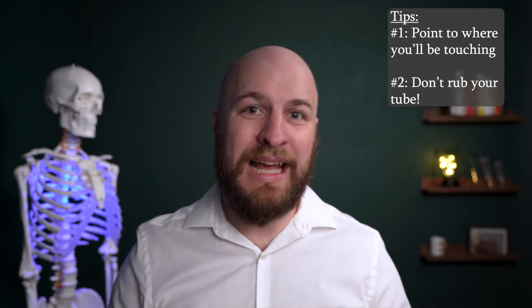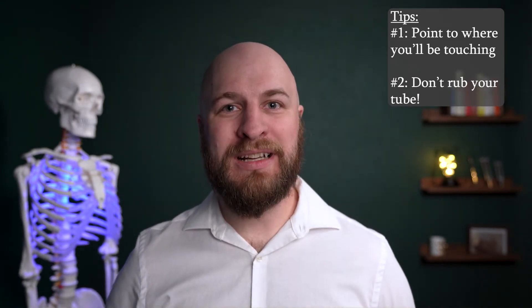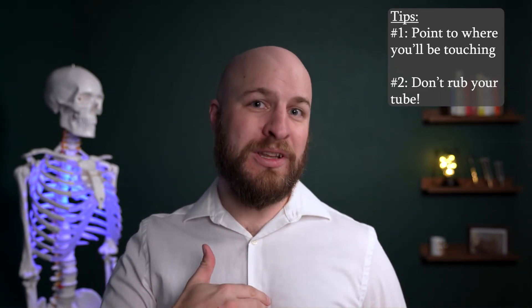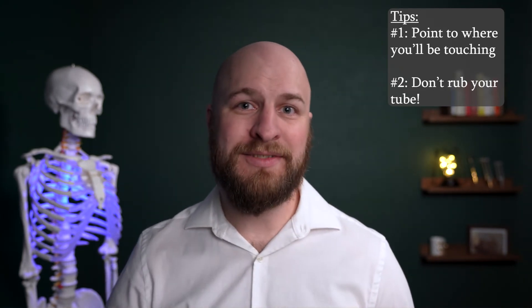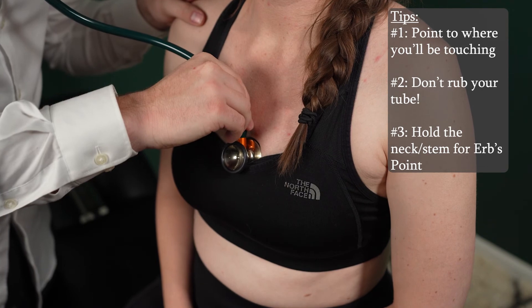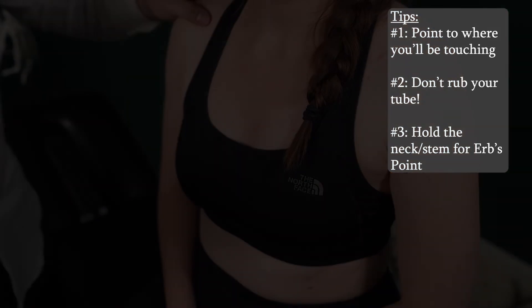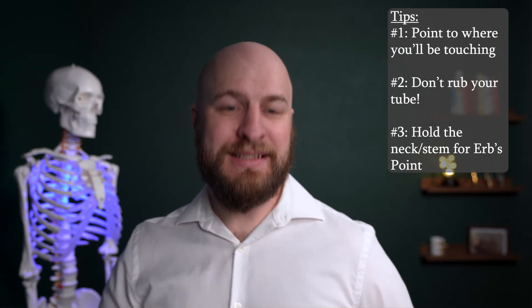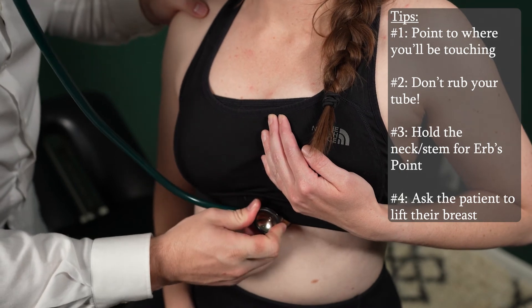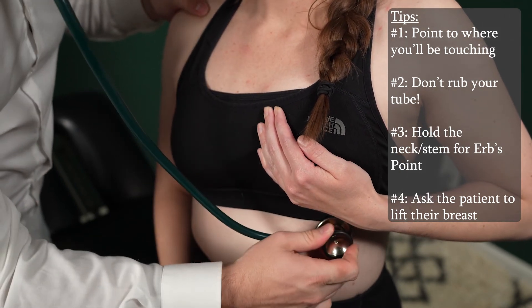There are times where it's a little bit hard to hold onto the bell and still maintain a patient's modesty. When listening to Erb's point — that third spot between the third and fourth intercostal space on the left — it's best to hold onto the neck of your stethoscope and slide it down to where you need it, then pull it back out. This is also why you point to where you're going to be listening, so the patient knows what to anticipate. For heart sounds at the fourth and fifth listening positions, it's best to ask the patient to lift their breast for you — they'll be happy to move that out of the way.